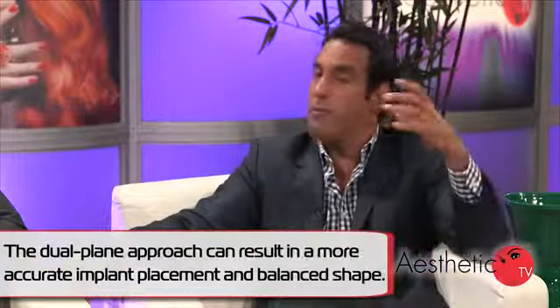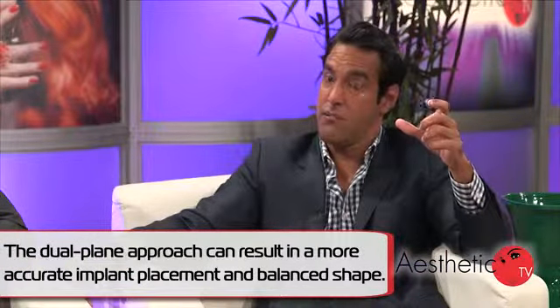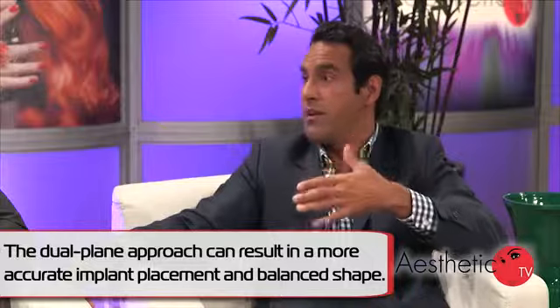And I think now is a good time to discuss placement of the implant, because there are options there: above the muscle, below the muscle, and what we call a hybrid, partially above, partially below. Well, I think that's right. In my mind, there are three big ways. One, subglandular, meaning just right under the breast tissue where we can put the implant. Another is totally submuscular, meaning right under the pec major muscle, surrounded by the other muscles. And finally, what we do, it's called the dual plane, where about 2/3 of the implant is below the muscle and 1/3 of it is below the breast tissue. This gives you the most natural looking result, in my opinion.